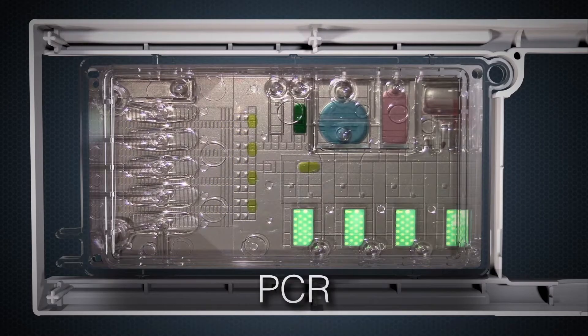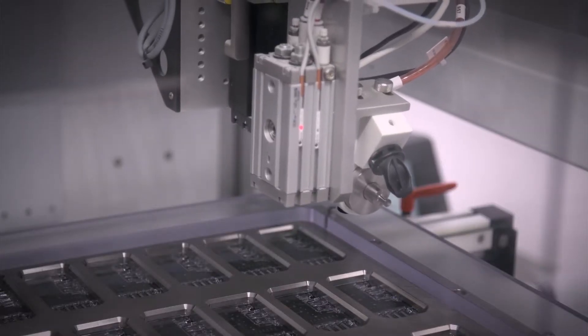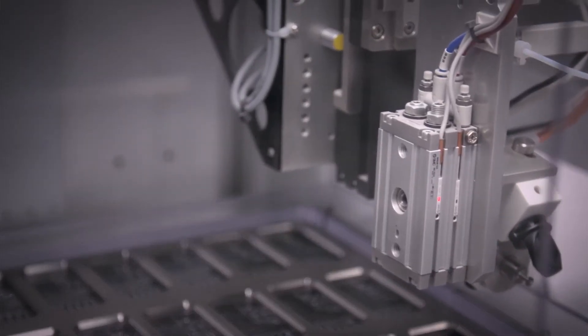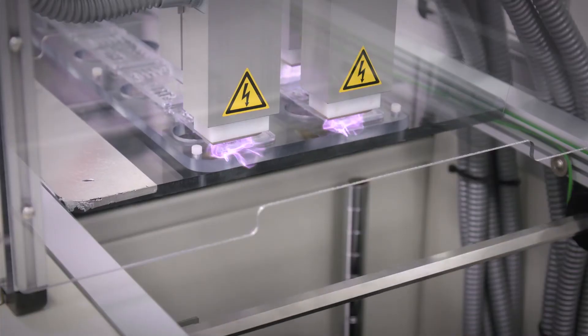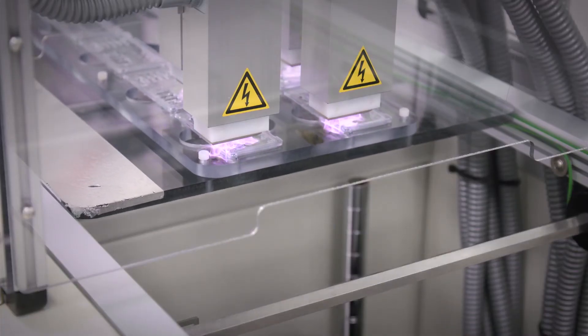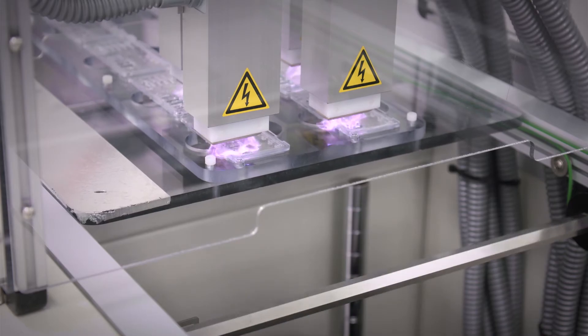To enable electrowetting, certain components of the ePlex cartridge are precisely coated with special materials. The equipment you see here is specially designed to thoroughly clean and prepare these components, to coat them with the required materials, and to ensure the materials are properly set and cured. These process steps are a key aspect of the unique amplification and detection steps of ePlex's sample-to-answer processing capability.